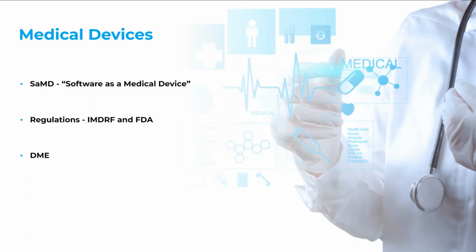And finally, on this slide, DME is, of course, durable medical equipment. But you need to understand how important software is for medical devices, because I feel like everyone looks at the device itself and believes that's what's going to diagnose or do the function you're looking at. But there's also built-in software in those devices. We'll look at firmware versus software.